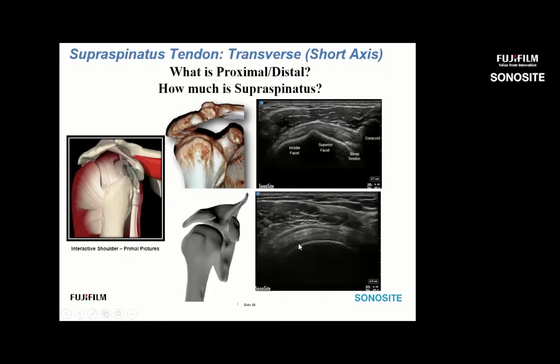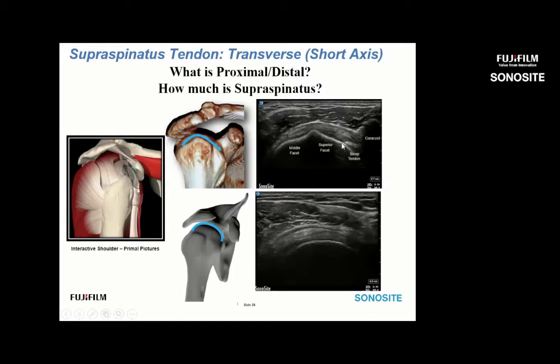Here we see the proximal portion of the supraspinatus and the rounded appearance of the humeral head. When we're over the rounded humeral head, we see an oblique line where the overriding infraspinatus fibers course over the underlying supraspinatus fibers. Look for this oblique line in the more proximal tendon to distinguish infraspinatus from supraspinatus. When over the greater tuberosity, we see this Matterhorn-shaped bony contour, with infraspinatus primarily on the middle facet and supraspinatus on the superior facet.